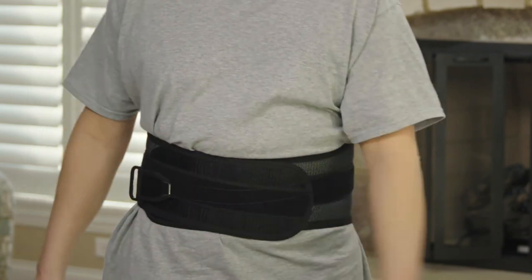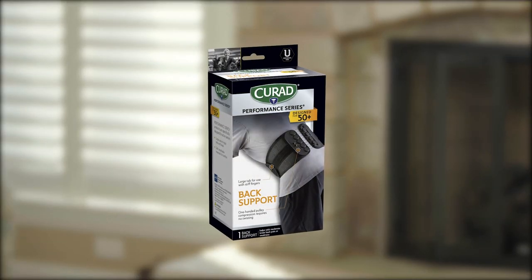Curad Performance Series 50 Plus. Designed for seniors and their needs.